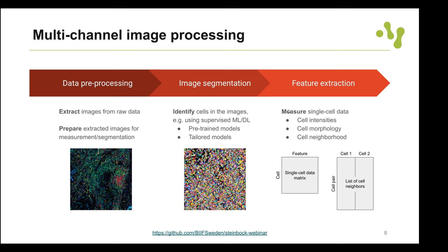The AnnData export command is slightly more complex: we export as AnnData specifying we want intensities from the intensities folder, additionally include regionprops as extra data, and include the neighbors from the neighbors folder — all to cells.h5ad. This generates one AnnData object, giving a warning that all data will be loaded into memory, which is necessary for constructing this object.